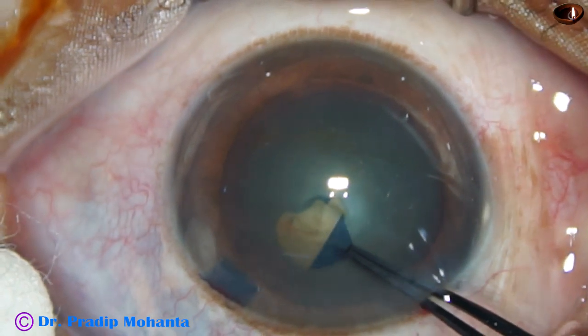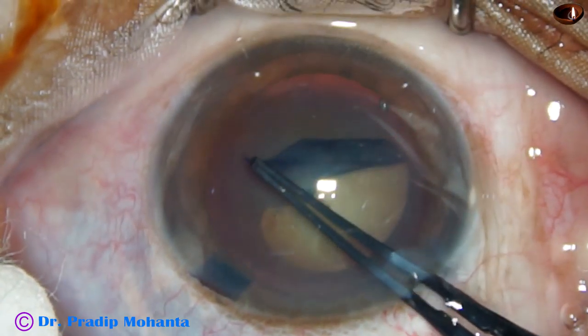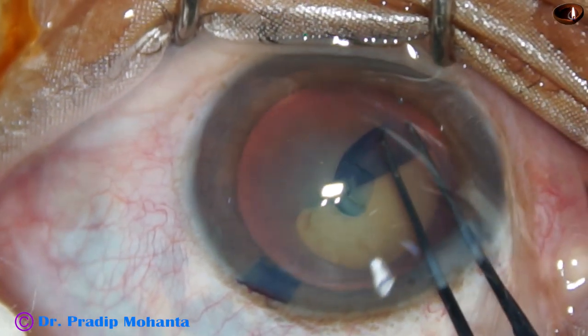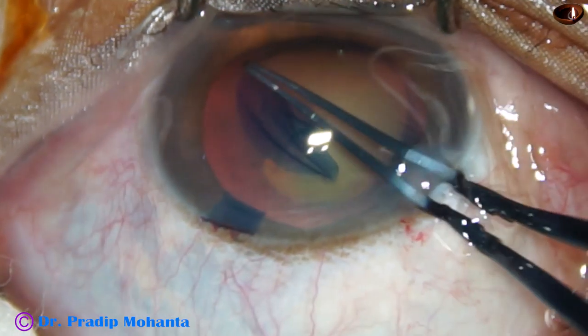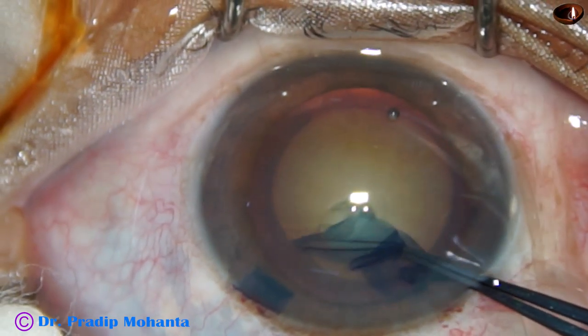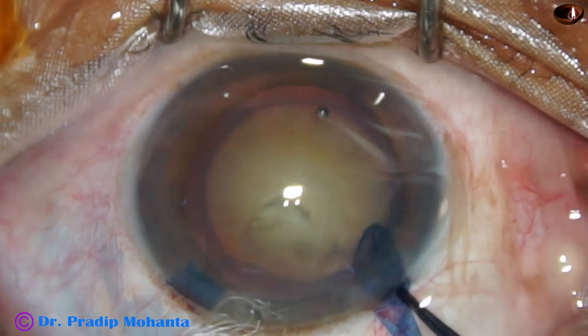This capsular tag is held with the instrument and I go anti-clockwise to do the rhexis. The capsular tag is guided in such a way that it is at a certain distance away from the margin of the dilated pupil, and thus I get a fairly round capsulorhexis.